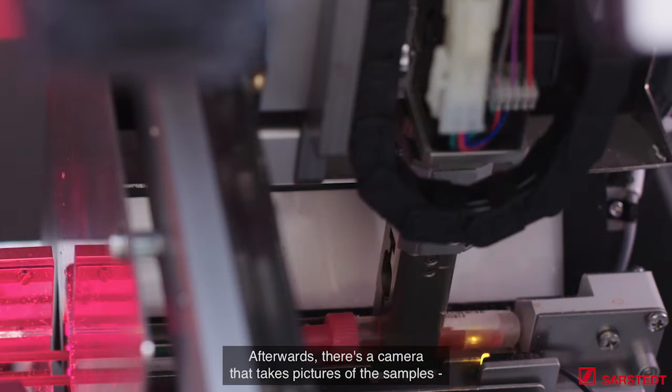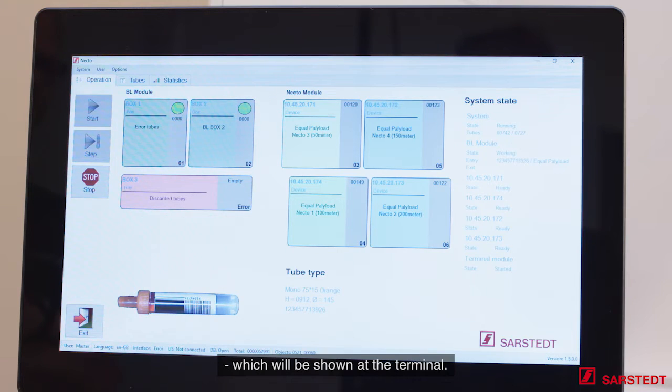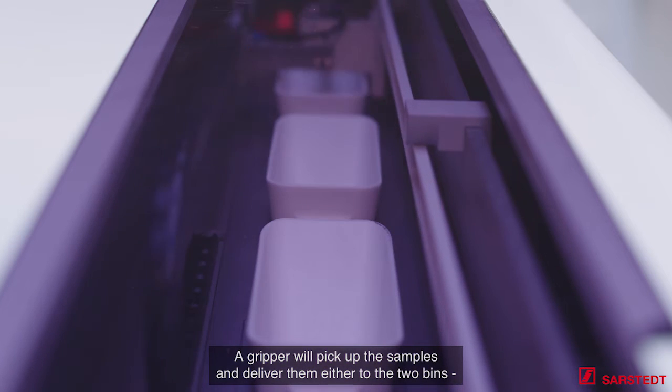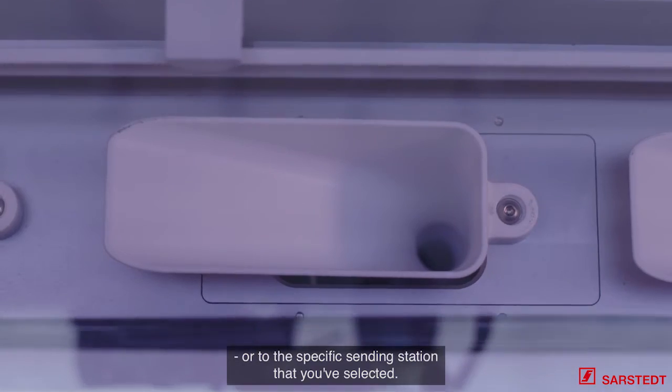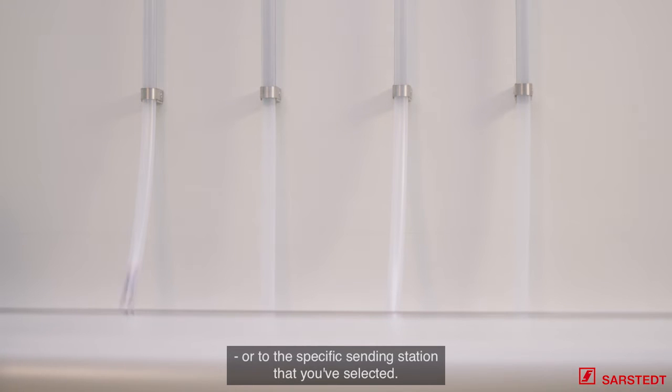Afterwards, there is a camera that takes a picture of the samples, which will be shown at the terminal. A gripper will pick up the samples and deliver them either to the two bins or to the specific sending station that you have selected to send the samples from.